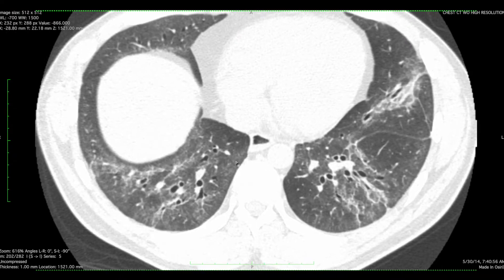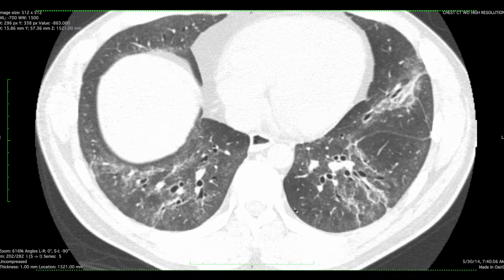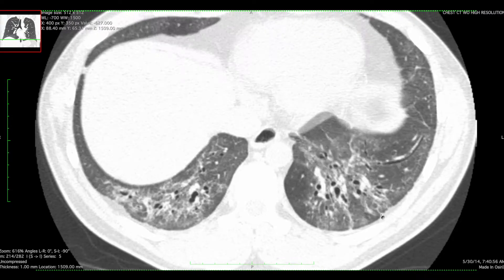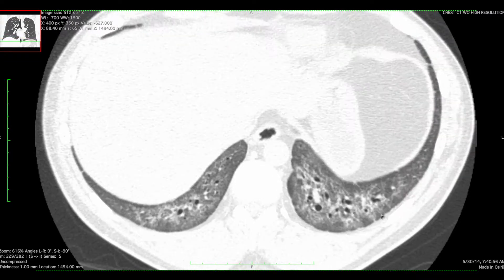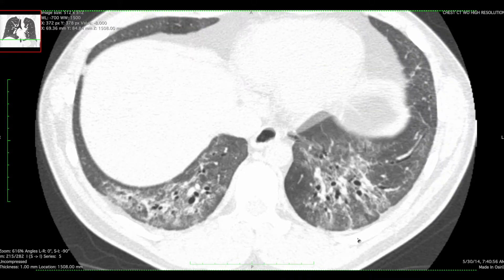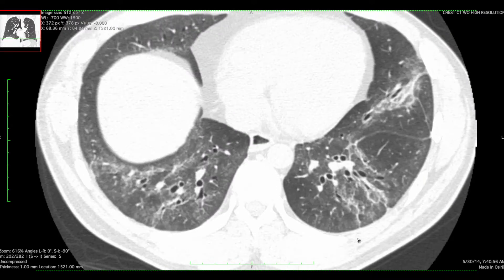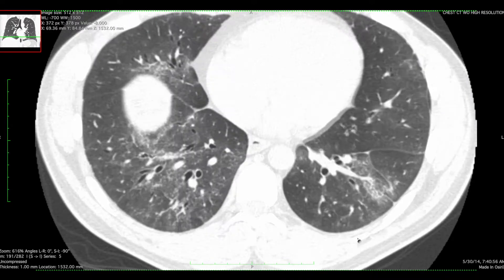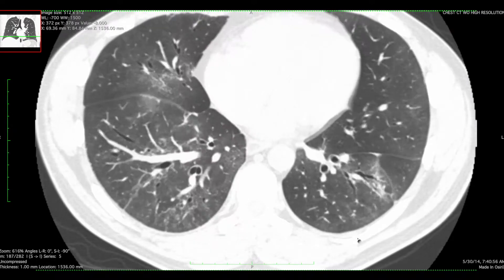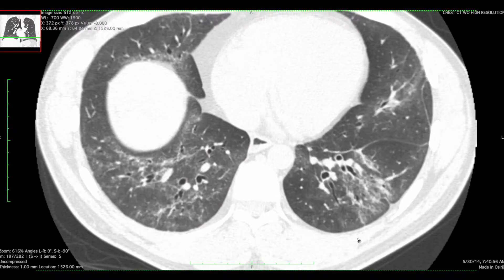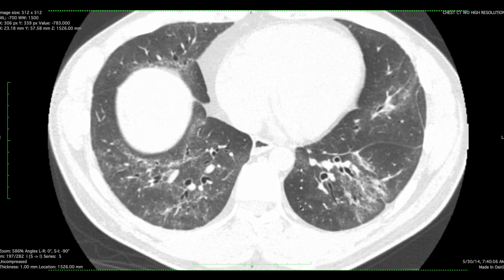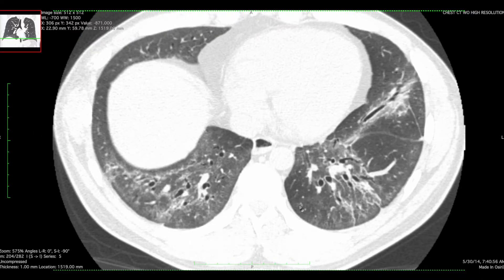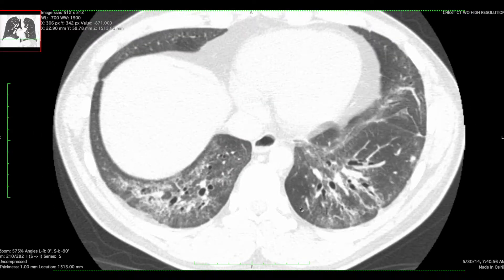If we magnify here, the most subpleural portion of the lungs demonstrates relative sparing. I think that's actually pretty convincing, this degree of subpleural sparing. In a lot of cases, this subpleural sparing is much more subtle, and I'll show you an example of that in just one second.